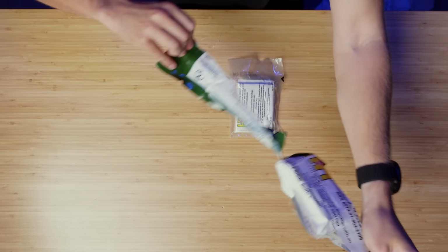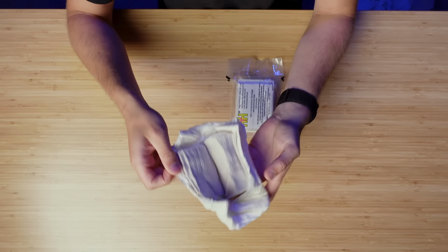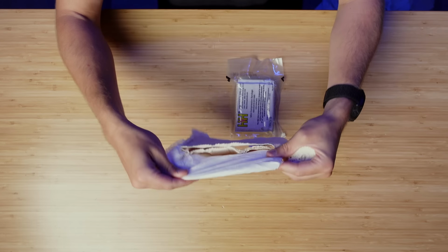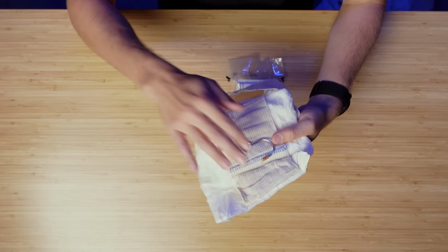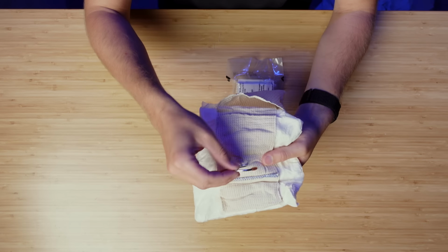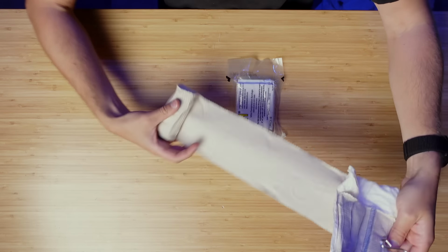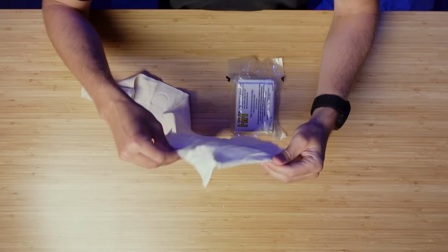So we'll go through the first main one. It opens all the way down and we get this neat little package. But this is the bandage. So the bandage kind of keeps it there. It's a huge absorbent pad, which is fine. Just make sure that this is located over it and you know exactly where you are putting pressure. Similar to the gauze dressing, it has this hook that's meant to basically give you leverage to make this a very, very tight dressing. You can put it through and then pull it back the other way and start wrapping it around. As far as I know, this is not a multifunction dressing like the gauze.